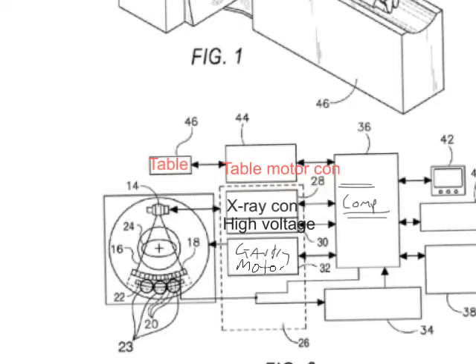All right. So we've pretty much talked about all the hardware, but we're going to start to segue a little bit towards the software stuff. And down here below the computer, we have this image reconstructor. Image reconstructor, I can't spell. Or write. I write like a 5-year-old.